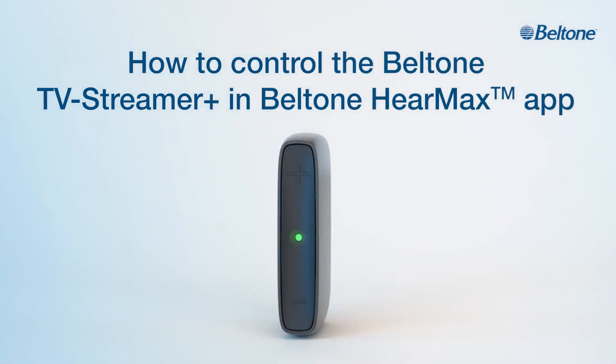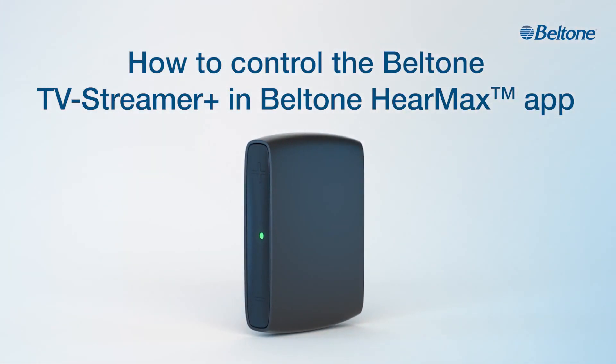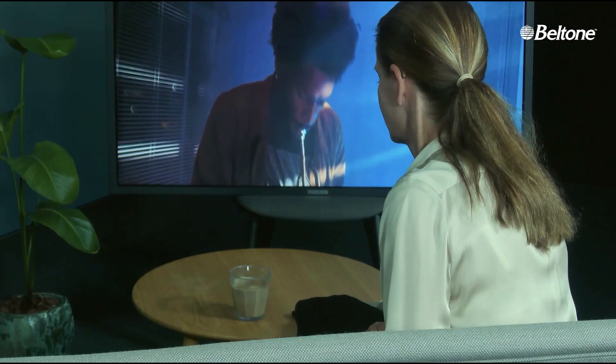A slim rectangular-shaped black device rotates on a white background. The Beltone logo is in the upper right-hand corner of the screen. Text: How to control the Beltone TV Streamer Plus in Beltone HearMax app.